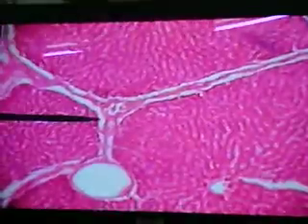And that central vein is going to lead into a sublobular vein, and these sublobular veins are finally going to lead into the hepatic veins, which will lead into the IVC, the inferior vena cava. As I said, what has happened in man is that a lot of the connective tissue has disappeared, and what really just remains is at the apex, or the apices, of these hepatic lobules.